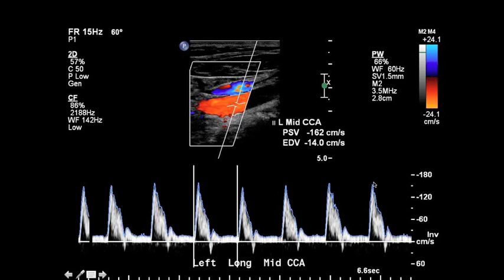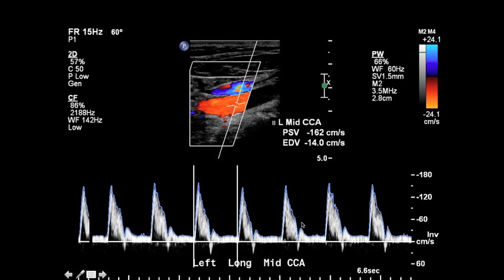One thing you want to notice with different ultrasound machines is how they represent inversion. You can see here that the negative numbers are above the baseline, and on this particular machine there's a small indication that says it's inverted. This tells you that the blood flow is actually moving away from the transducer even though it's being represented as above the baseline on the spectrum.